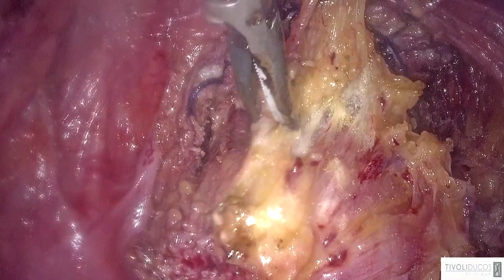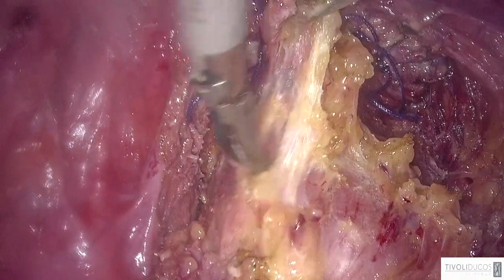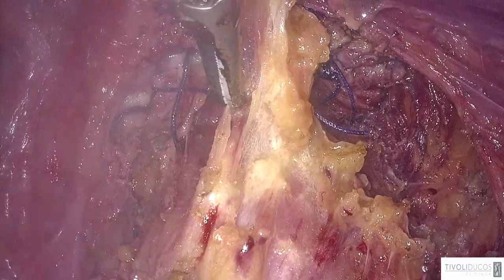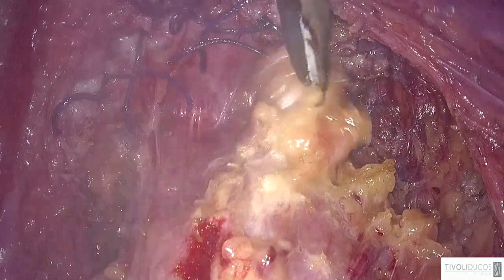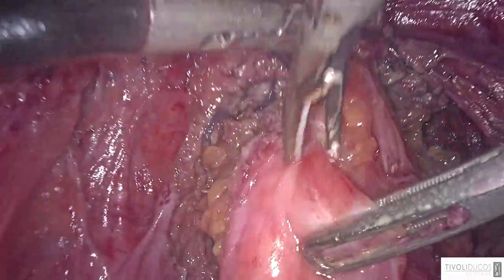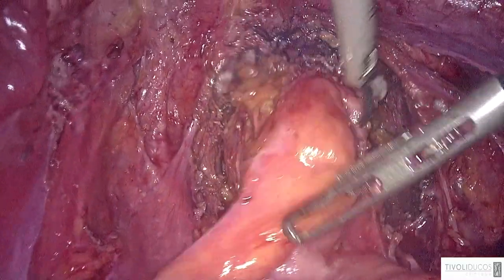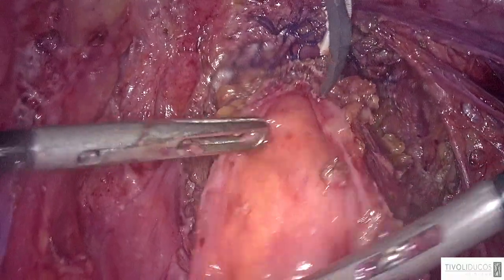So I always try not to hit too much the tissue, and here we are. I think we completely turn around the nodule. So the nodule is here. Let it down. You can let it down. So the nodule is here. Very well. We have some fat tissue here. Let me see. Where is the rectum, my friend? Put it in the middle like this. Yeah. Like this. Okay, so I have some fat tissue here.